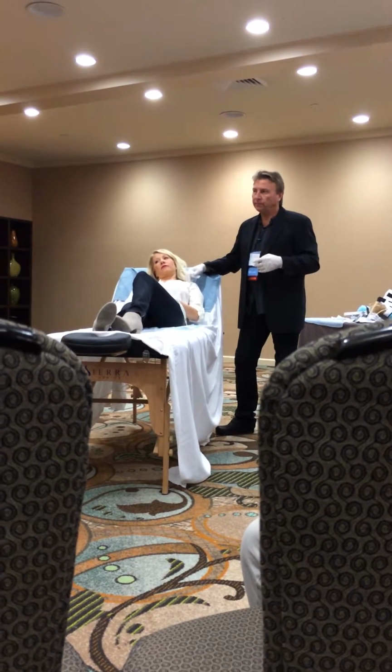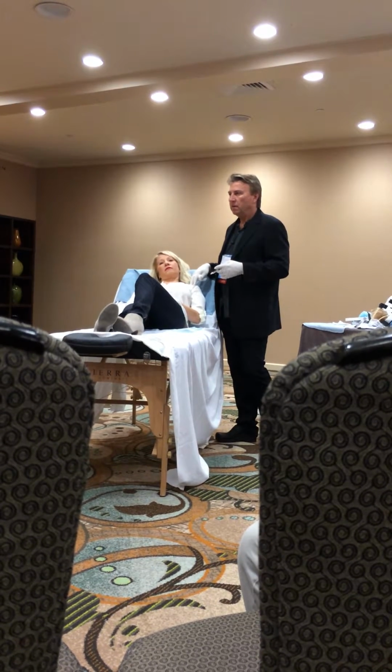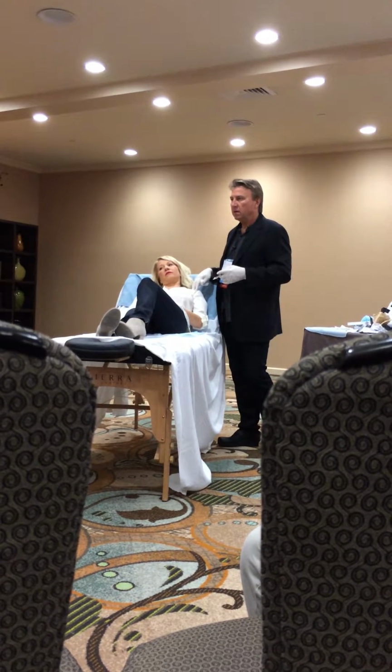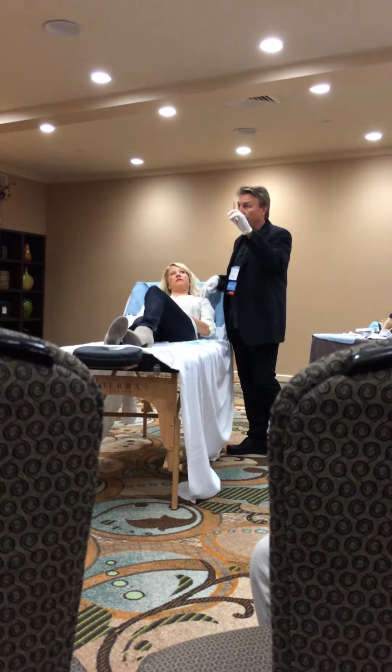If I got half a syringe, I keep looking for other spots. Most patients are okay with you looking somewhere else if they want to fill, and all of a sudden you find some other area where you can finish a syringe up. You could finish a syringe and a half really easy.